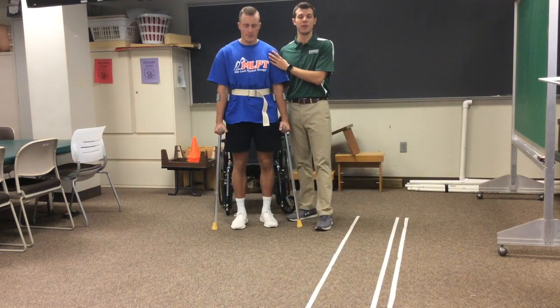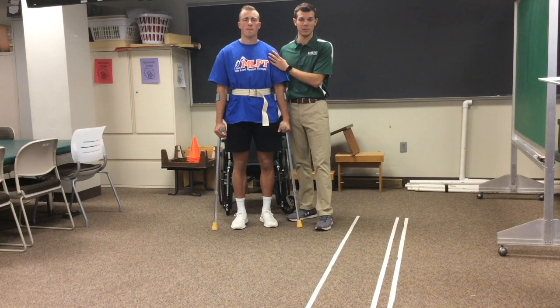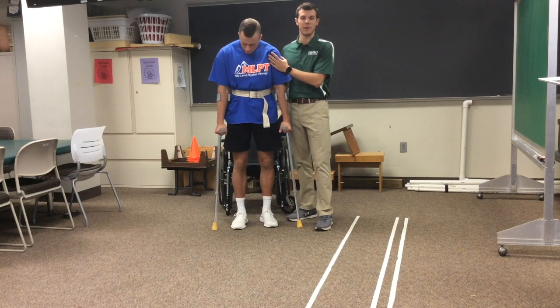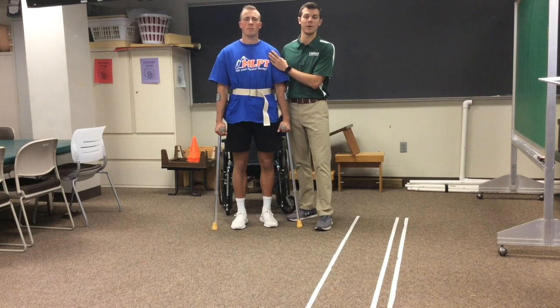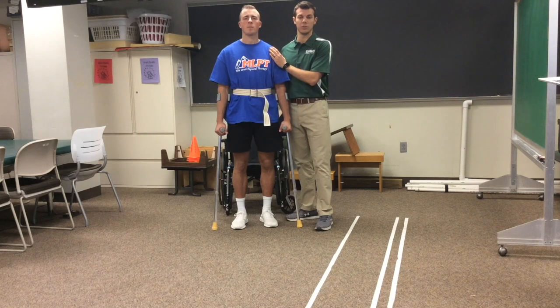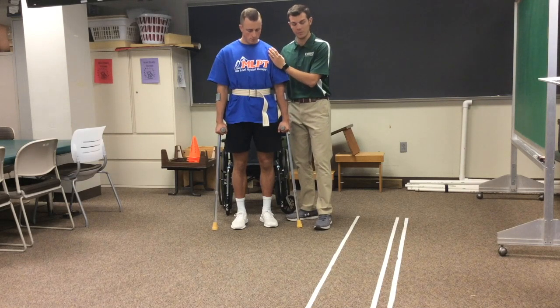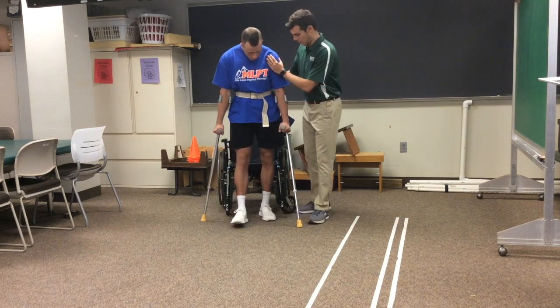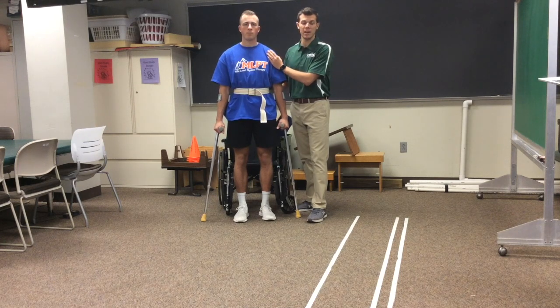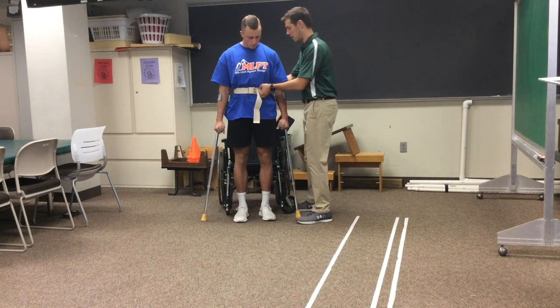Now we've already demonstrated the two gait patterns. Now we're going to learn how to safely bring Josh from the standing position into the wheelchair seat. You'll notice that I still am maintaining the proper positioning of the therapist with my feet in the L position, and my hands located on the shoulder and supinated on the gait belt. Now Josh, if you'll back up slightly so that your calves come in contact with the wheelchair seat.